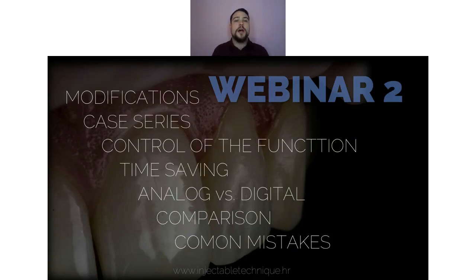In the second webinar, we have a series of clinical cases with different clinical situations and different modifications you can use in those situations, covered with photos and videos of real everyday patients, both analog and digital, comparison, and combination of different materials, ceramic, composite, and so on. We speak about the control of function, because this is a very important part for the longevity of your composite veneer. So far, knock on wood, I haven't had any problem regarding chipping or fractures of my veneers in 5 years of experience with this technique.